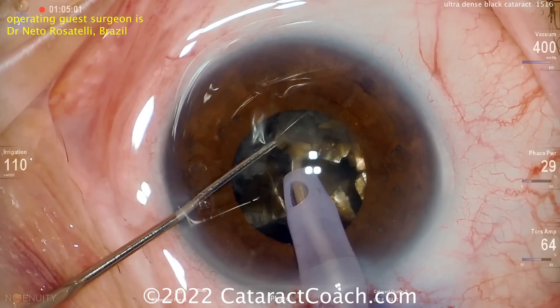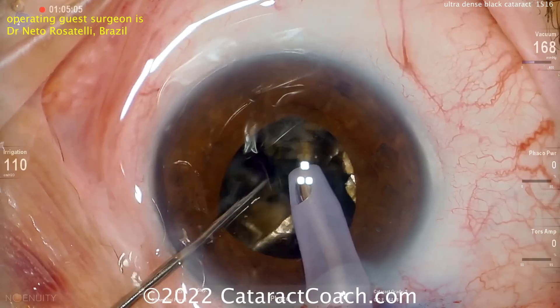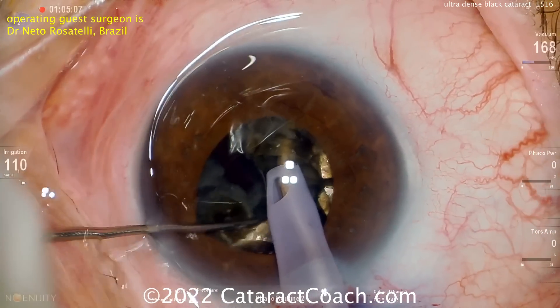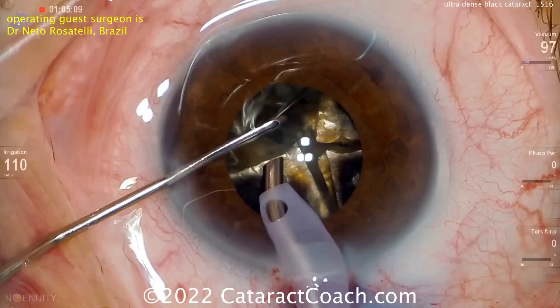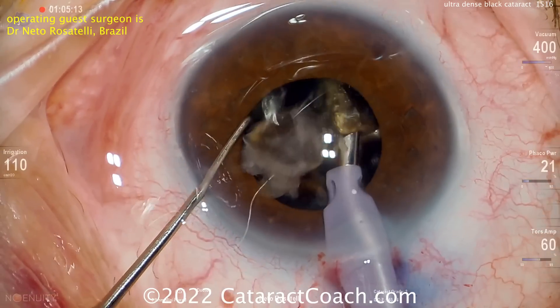Look at that density — chopping it in half. So that quadrant now becomes two-eighths. Split those apart and they can be removed. You're going to end up using a lot of phaco power on this. To get these pieces emulsified, it's a lot of phaco power.